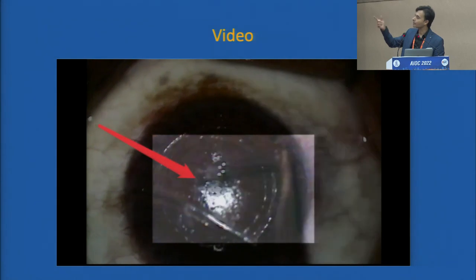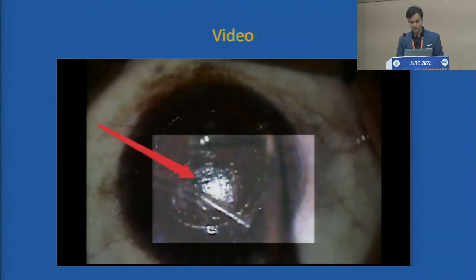So now in this case, it is crucial. Is it so accurate that you can do it? No, sir, because I can visualize it in this case, and it was isolated. So in this case, it was possible, but not always. So for example, if you have more extensive one, you will have to open up the full flap.